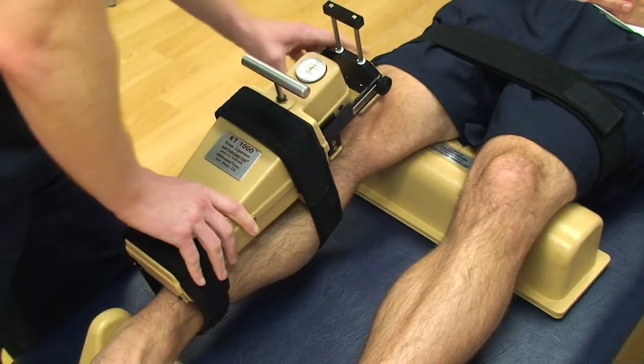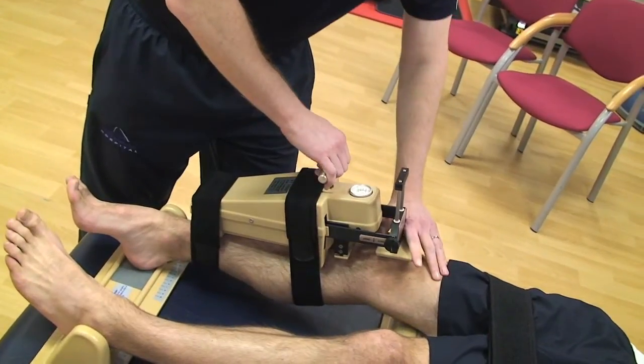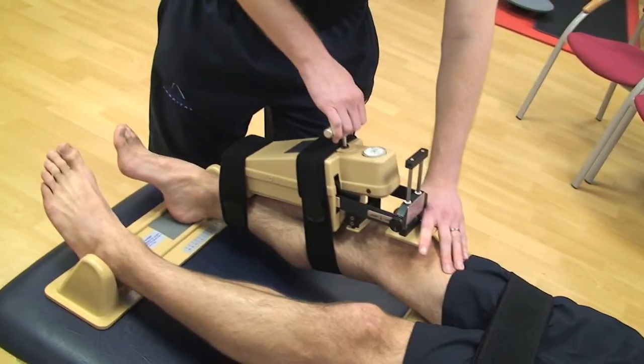We at MLH Physio work closely in conjunction with Mr. Jara, the Orthopaedic Knee Consultant, to provide this test and give him a quick, accurate result as to whether you may have suffered an ACL tear.